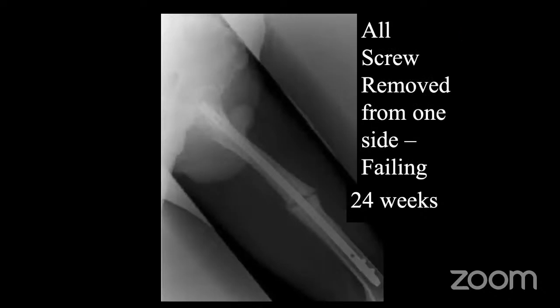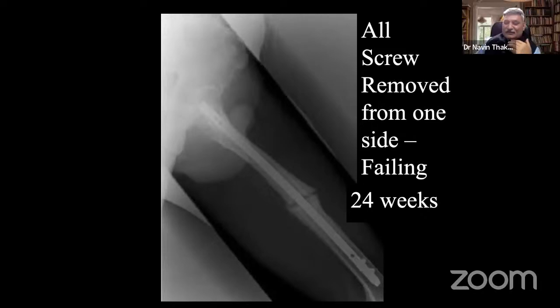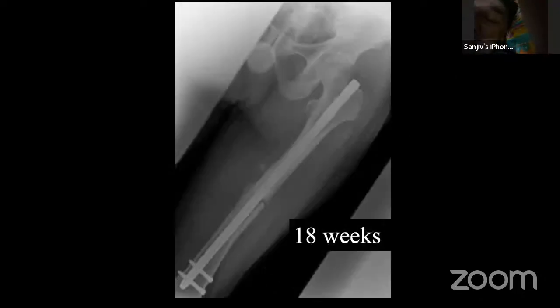So it has become a more unstable construct by doing dynamization. So many times dynamization does not help, it harms. That is the message. So what was wrong here? What was wrong with the dynamization technique? Can anybody say the principle of dynamization and what was wrong in this case?